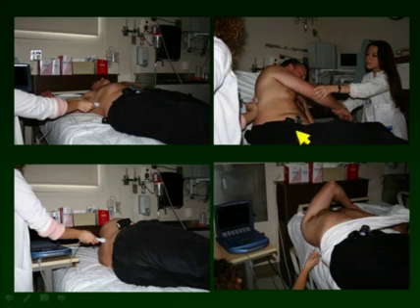this patient, a couple of lines in, very unstable. This person has to hold it for 10 or 15 minutes. This is often impractical in patients who are very, very sick.